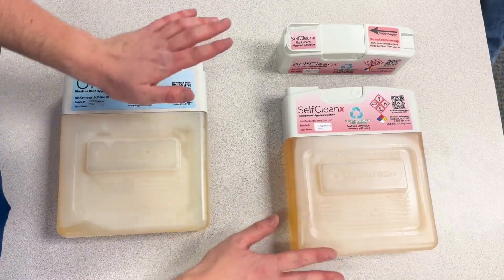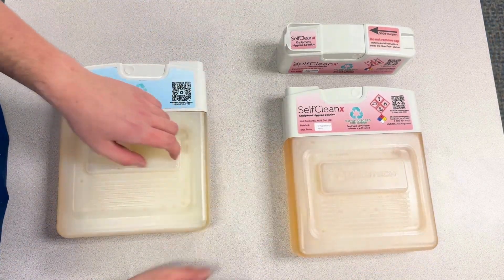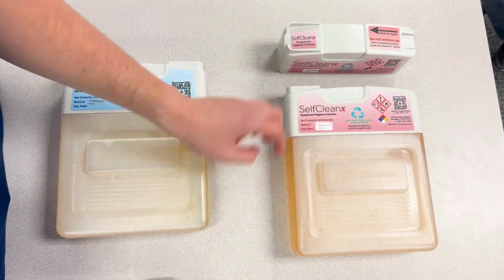For a self-clean cartridge, it's the same idea. Even though it's the opposite direction, the recycle sign and QR code still face the side that says Meritec.